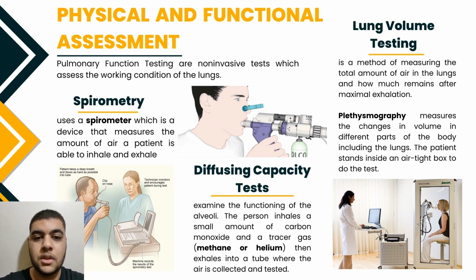As we can see in the picture, the patient puts a small clip on his nose and a small tube in his mouth. The patient takes a deep breath and blows as hard as possible into the tube. Then the device records the amount of air the patient is able to inhale and exhale.